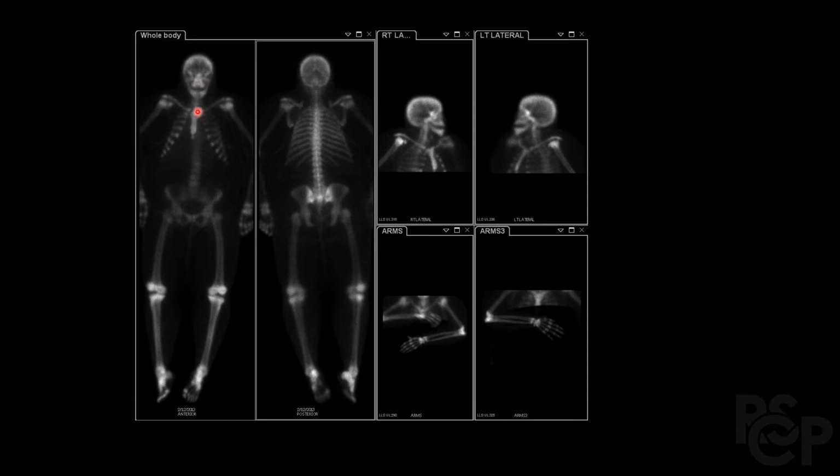This is known as a sternal tie, which is also indicative of metabolic disease, and the ribs along here show what is known as costochondral beading. And we can see the symmetrical appearance in the tissues in the joints area over here as well. So again, these are signs that are commonly indicative of metabolic disease.